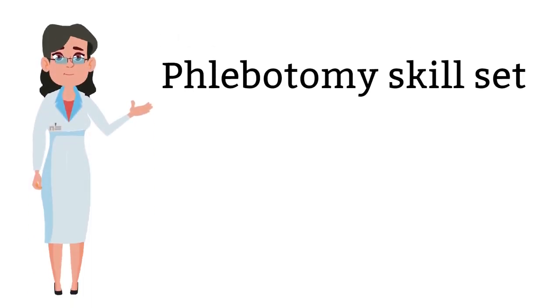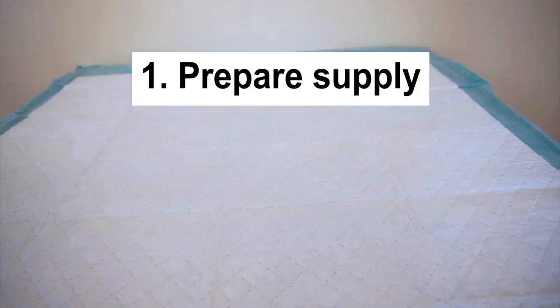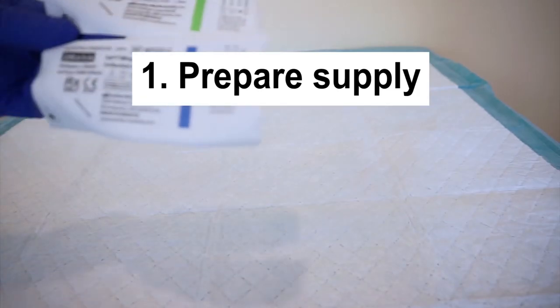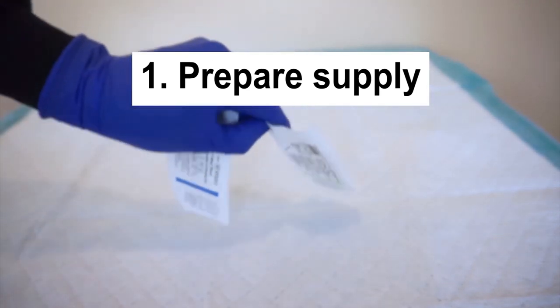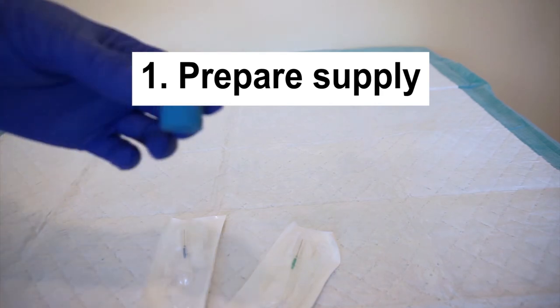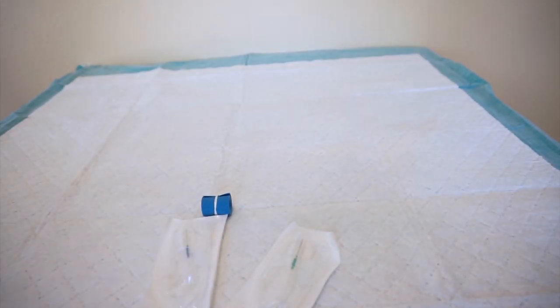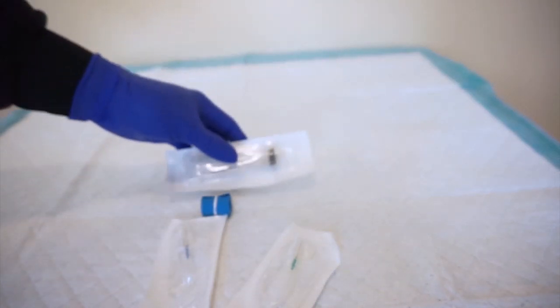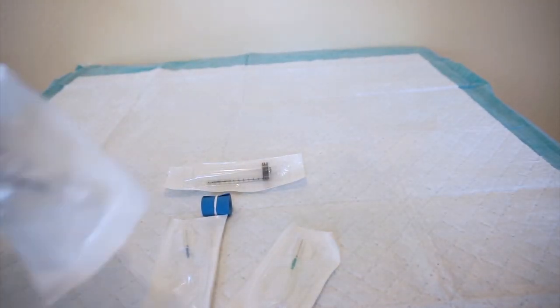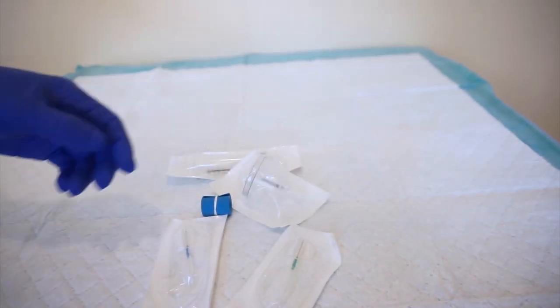Now, let's discuss what's going on in the video. First, prepare phlebotomy supply. Assemble the syringe needle. The additional supply that you will need for this method is a transfer device. The syringe can be attached to the needle directly or attached to the butterfly needle. Choosing how big the syringe is also important. You want to choose the syringe size according to the amount of blood you need.